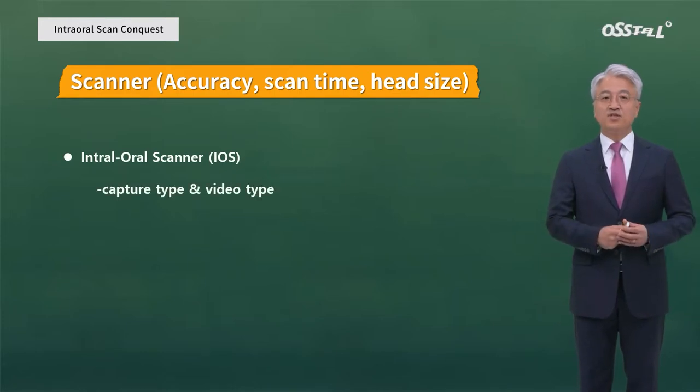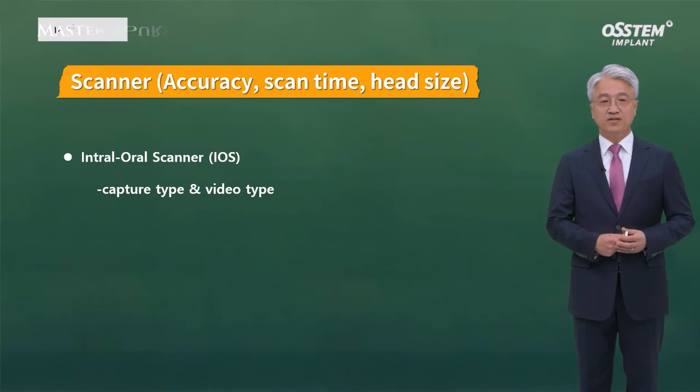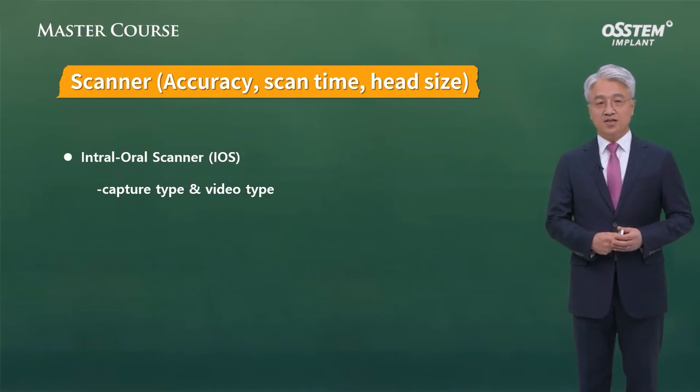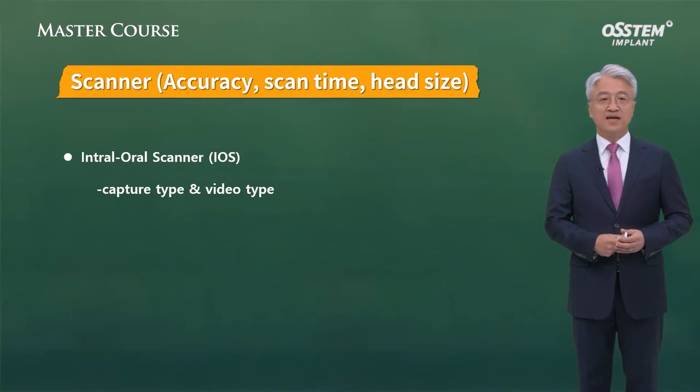Intraoral scanner can be divided into capture type and video type. The scanners that are used frequently is video type. Compared with the capture type, the accuracy is better, and the contents that can be reproduced is better. Therefore, video method is becoming more widespread.